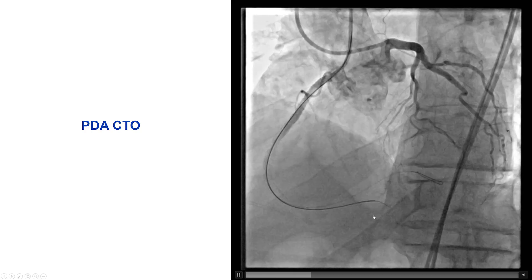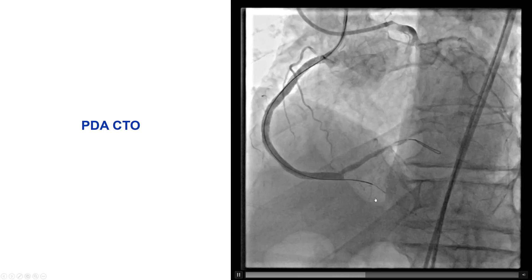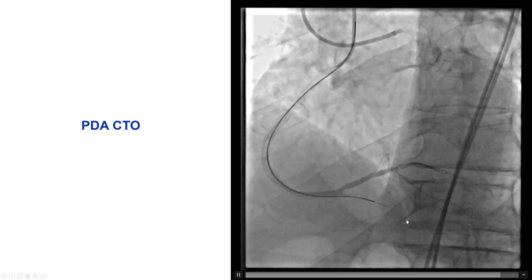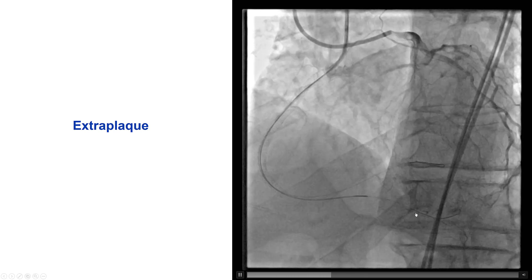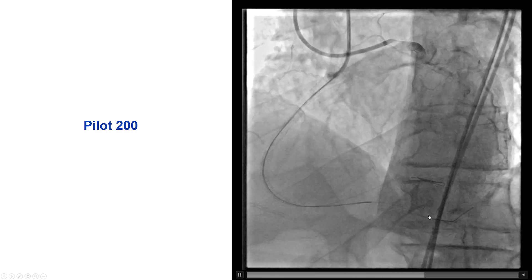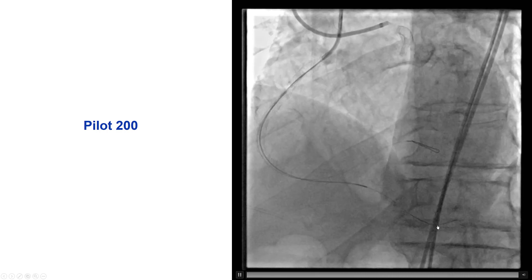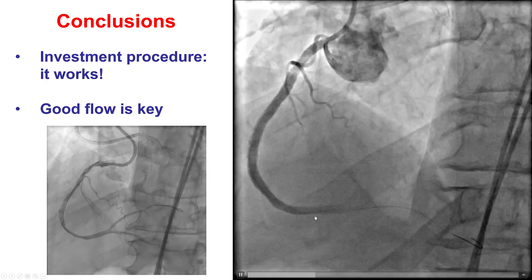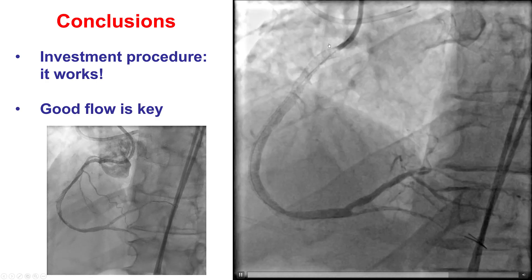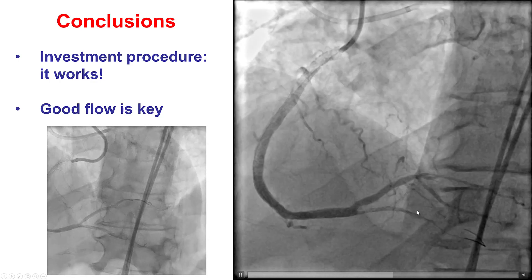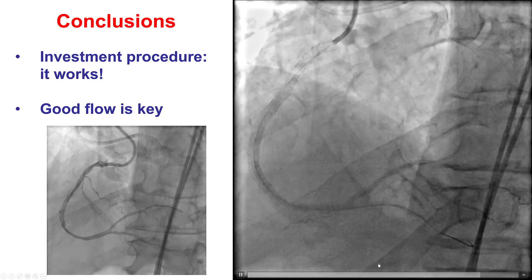We decided to attempt to re-canalize the RCA CTO, so we did antegrade wire escalation with the Corsair. The Fielder XTA seemed to enter into an extraplaque plane, so it was removed, and then we used the Pilot 200, which this time seemed to advance within the distal true lumen. Given the small size of the vessel, we performed inflation with a 1.5 millimeter balloon and ended up with a nice final result, with TIMI flow into the RCA, posterolateral, and PDA. We did not place any stents in the PDA due to the small size of the vessel.